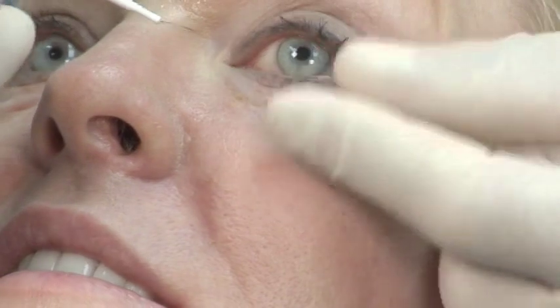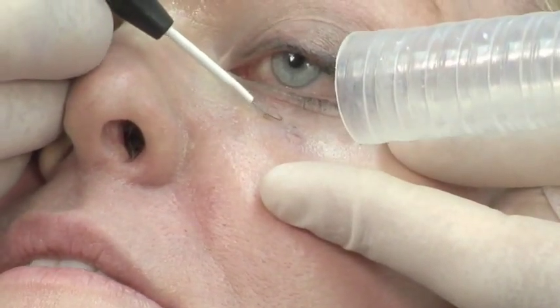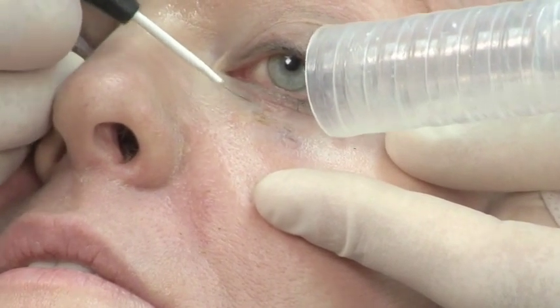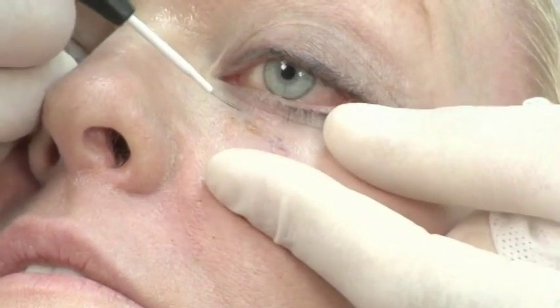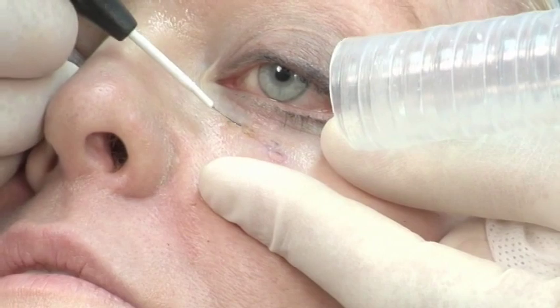You're going to find it's a lot easier to recover from this — a little lasering around the mouth will be a little longer, but you're doing great. I think Julia's very comfortable, and I believe she's going to like the recovery period on this a lot more than her laser treatment of these spots eight years ago.